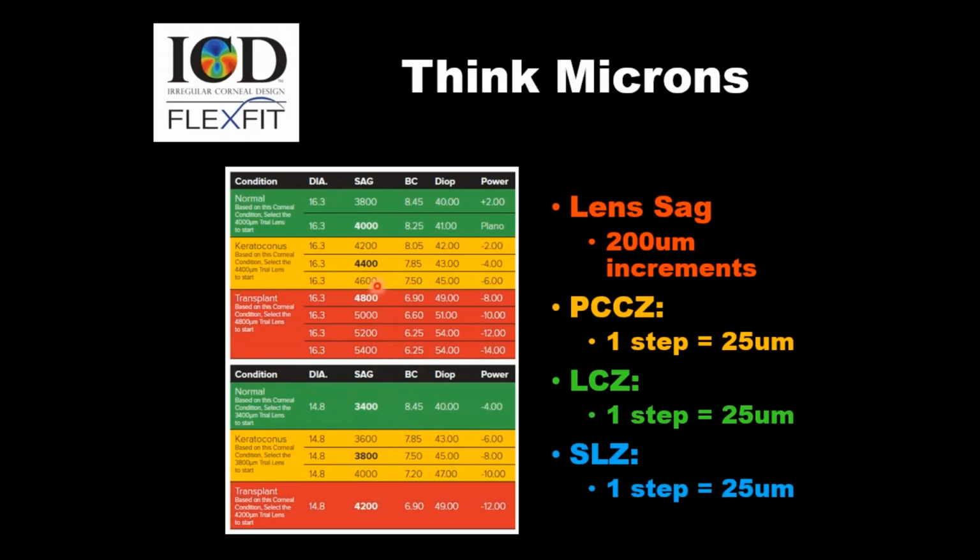What's the height of lens we need? Ignore the base curve. It's not important. What is important is the depth of the lens. So sag is the reference you're always going to use.